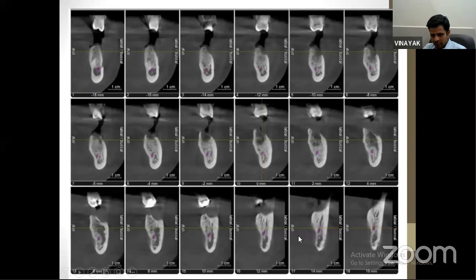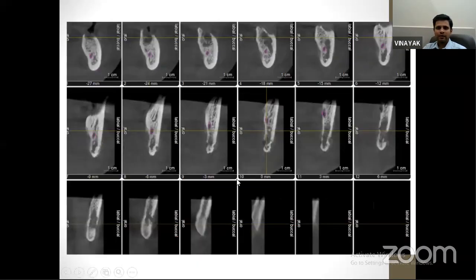posterior body. Now if you see the cortex, normally it is white, right? It's bright white. Now if you see dots in this cortex, right? So this is typical of osteomyelitis, where you see radiolucencies in the cortex giving it a moth-eaten appearance, which is characteristic of chronic osteomyelitis. Like how a moth eats a leaf, right? This is a similar appearance, which is seen.